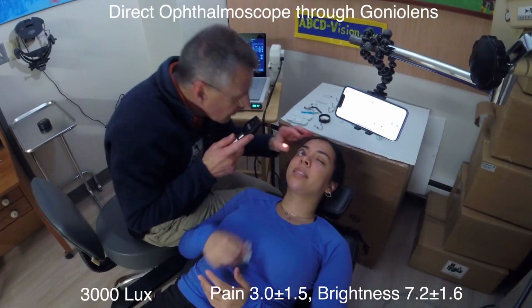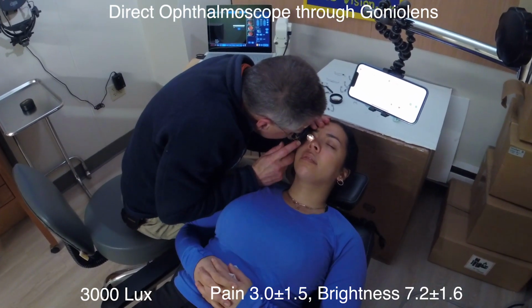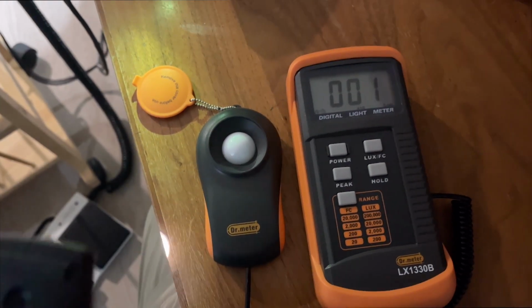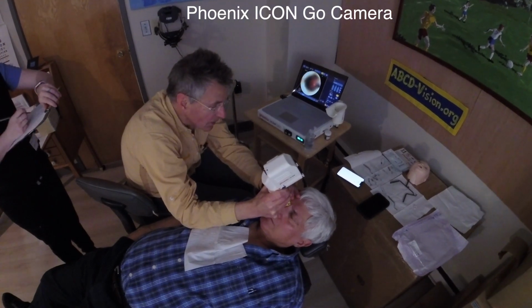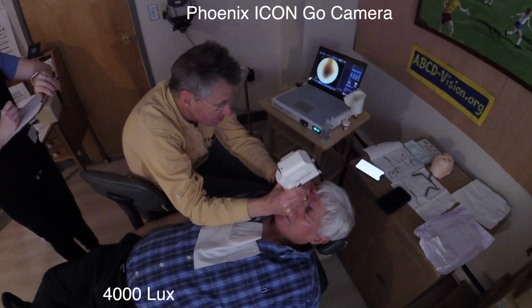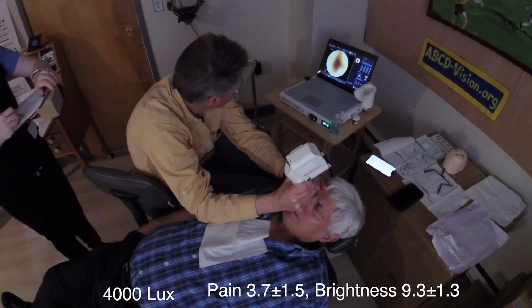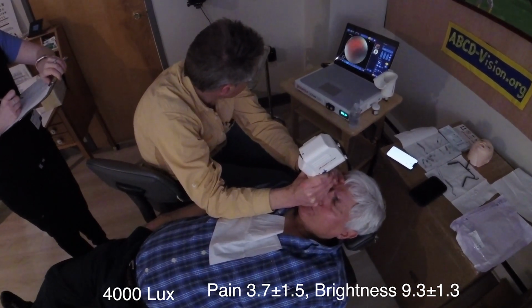Okay, now this is the direct ophthalmoscope. Now this may seem pretty bright. Yeah, that's pretty bright actually. I think the brightness is around a 10 on this one, or a 9 anyway. It's interesting. It's bright, but it's not painful. The Phoenix Icon camera.